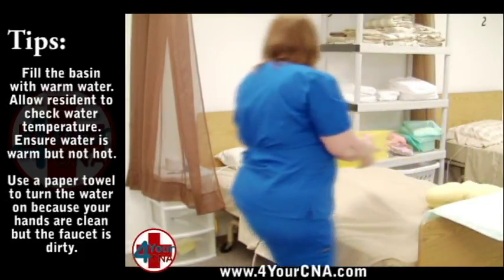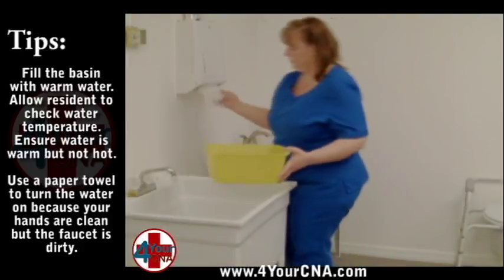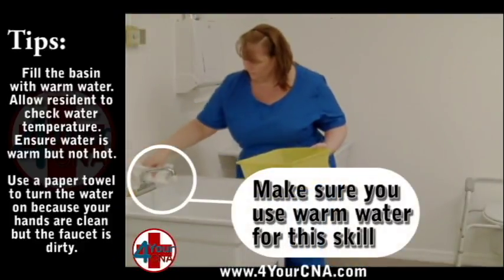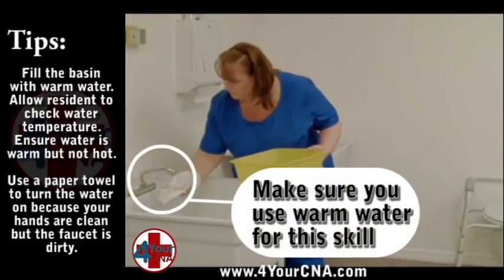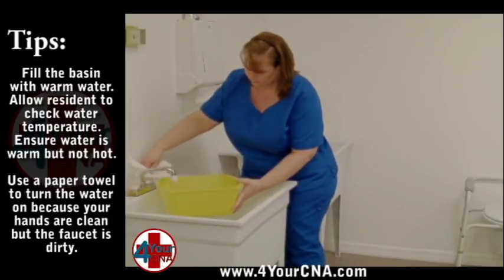Obtain a wash basin and soap from the bedside cabinet and place the soap on the overbed table. Take the basin to the sink to fill with water. Use a paper towel to turn the water on, check the water temperature with the inside of your wrist, and fill the basin one quarter of the way full. Turn the faucet off with a paper towel and discard the towel into the trash.